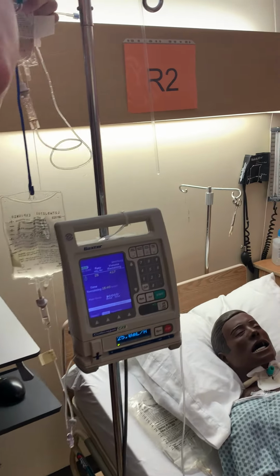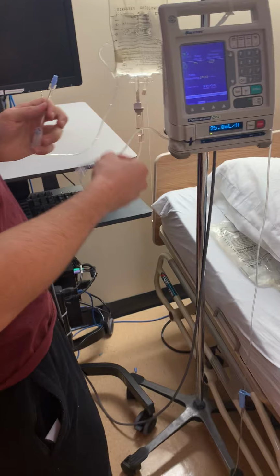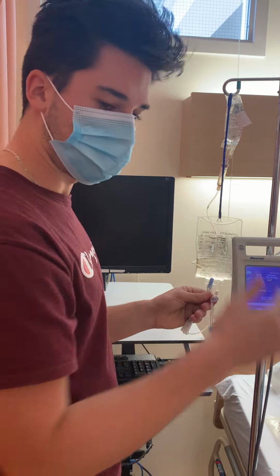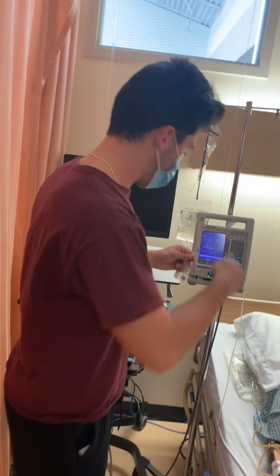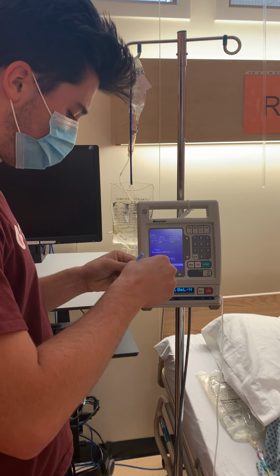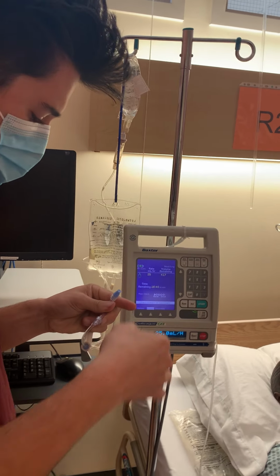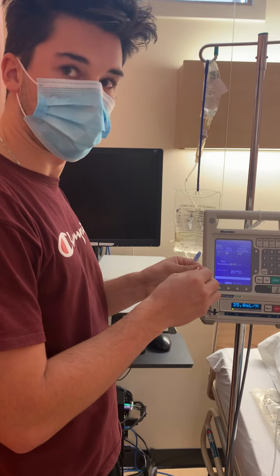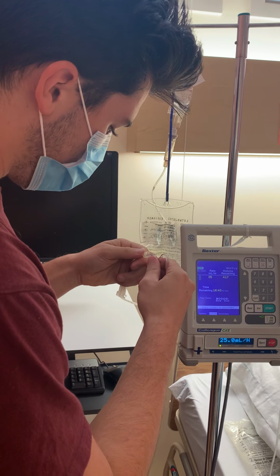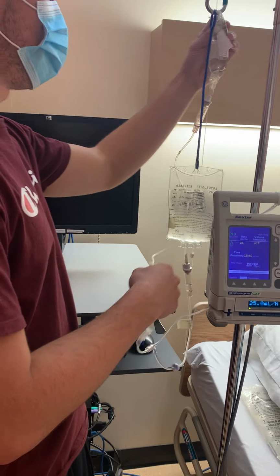I'm going to hang up the medication, and then once I've hung it up, I can go ahead and attach it to my primary. I'm going to choose the port before the pump, so the medication can be regulated by the Baxter pump. I'm going to grab an alcohol swab, open it, and swab for 30 seconds, let dry for 15, and throw that in the garbage. Then once I've swabbed that, I can go ahead and unclip this and attach the two sterilely. I'm going to sterilely attach the two ends, and then I can go ahead and back prime.